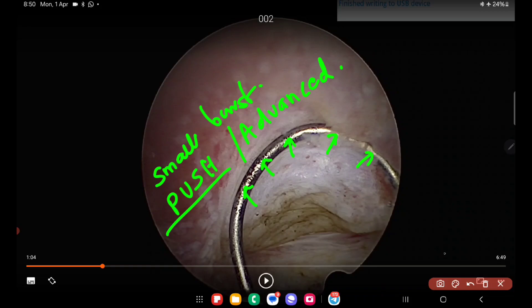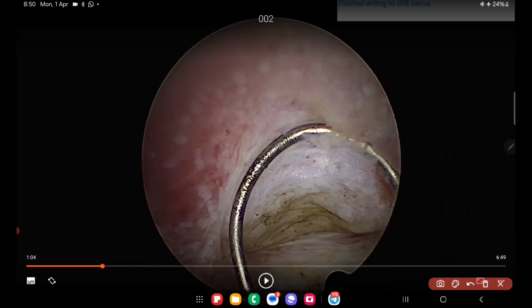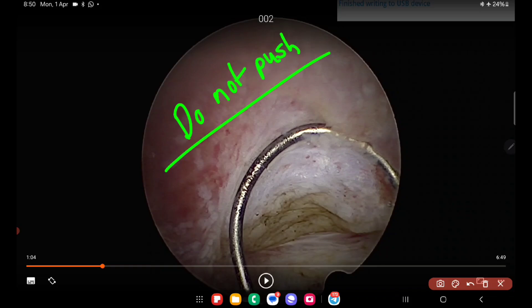For beginners, the standard teaching dictum always is: do not push with the resectoscope. If you are in the early part of the learning curve, do not attempt this maneuver. Later on, you will find this maneuver very helpful in dislodging the fibroid from its attachment to the myometrium, converting a deeper type 2 or type 3 myoma into a type 0 or type 1 myoma.